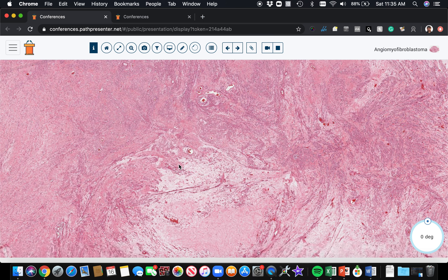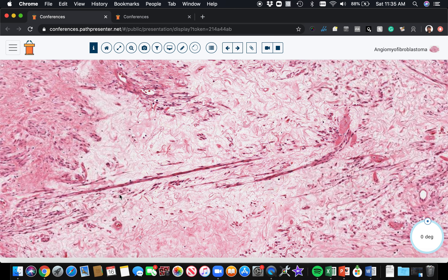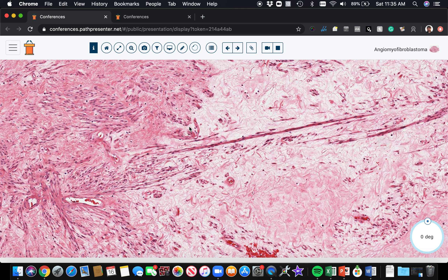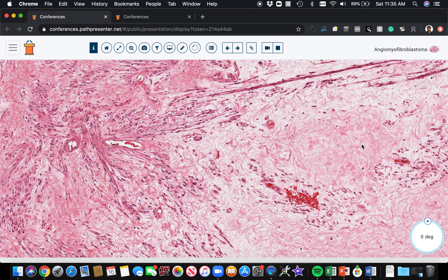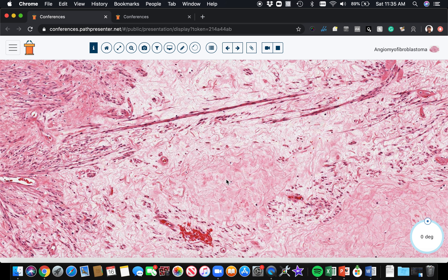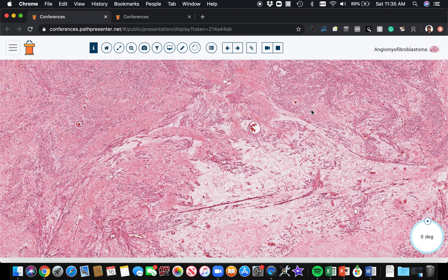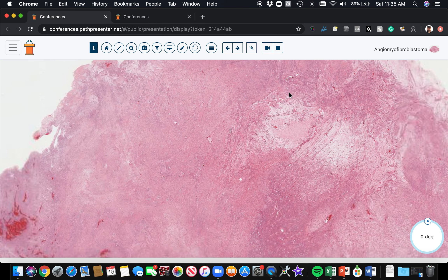Here's an area with really prominent cords — very long chains and cords of tumor cells stretched out in the midst of an edematous background. On immunohistochemistry, these cells classically tend to be positive for desmin, as well as for estrogen receptor and progesterone receptor. Do keep in mind that ER and PR can be positive in many different neoplasms in the female genital tract. Those are the features of angiomyofibroblastoma.